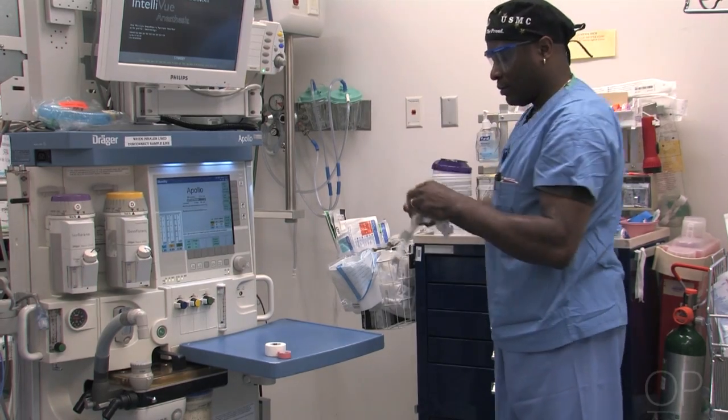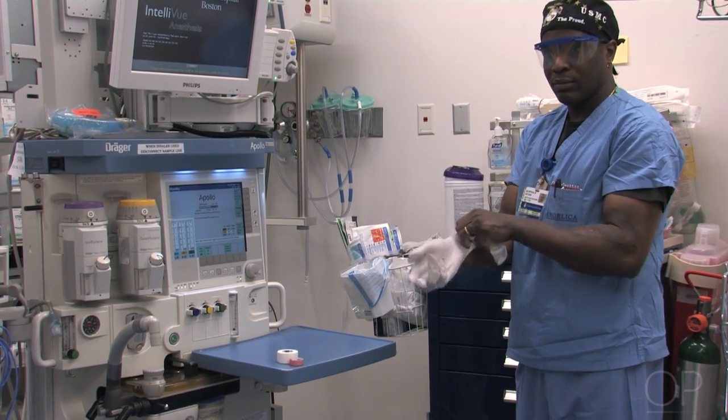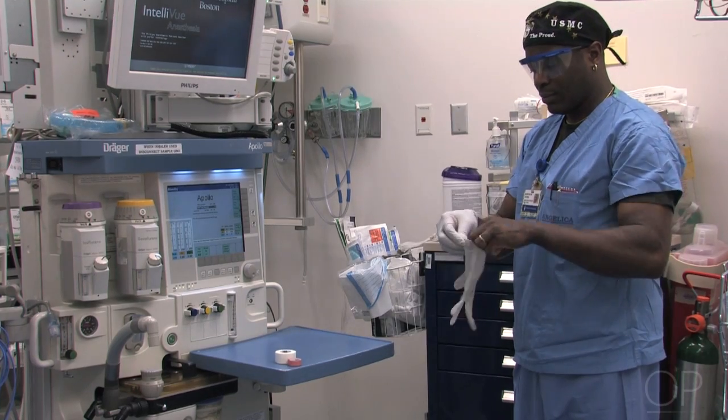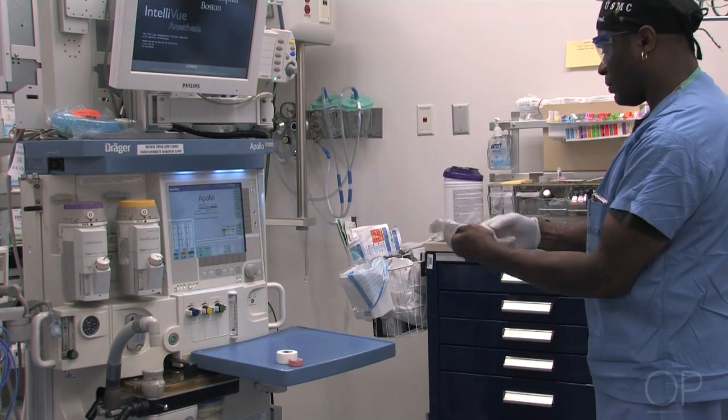Once all items are wiped down, the gloves and wipes are thrown away and a clean pair of gloves are put on. Once this is accomplished, a new setup is ready to be set up.